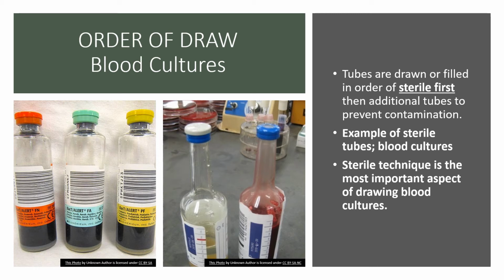And then we need to worry about aseptic technique. We will go over that in lab, and you will understand what aseptic technique is. And then we understand that there's different things in that tube, from media and broths to anticoagulants to chemicals, right? And if you'll notice in the picture over to the right side, there's two bottles there, right? Because usually there's an aerobic and an anaerobic.